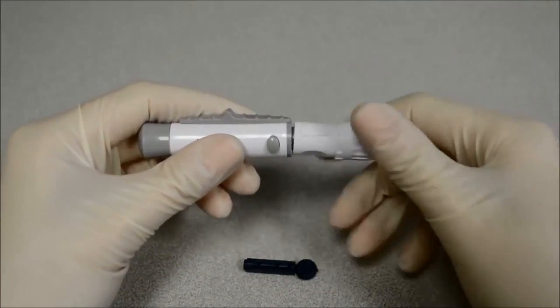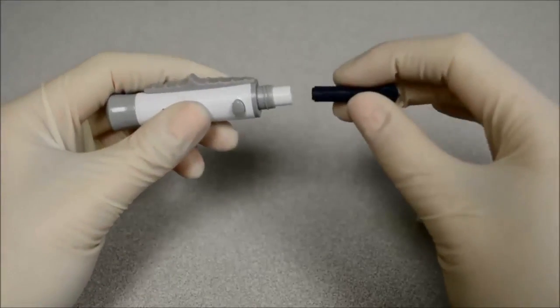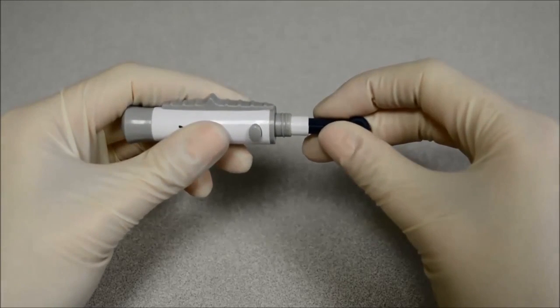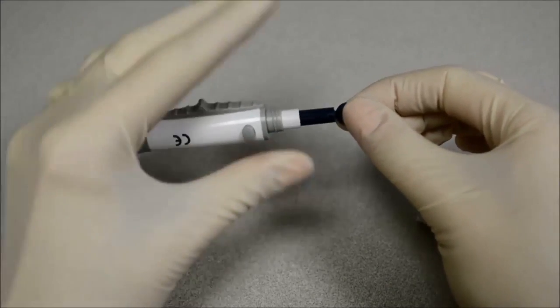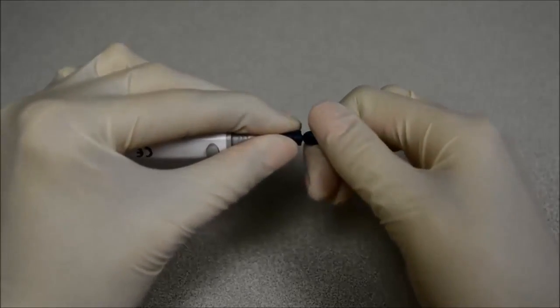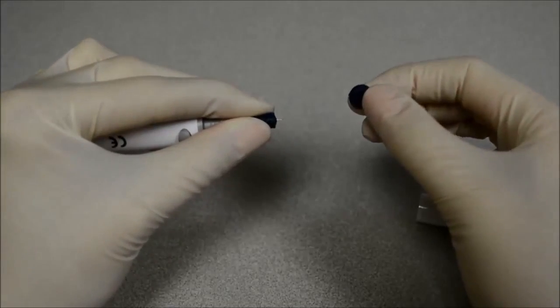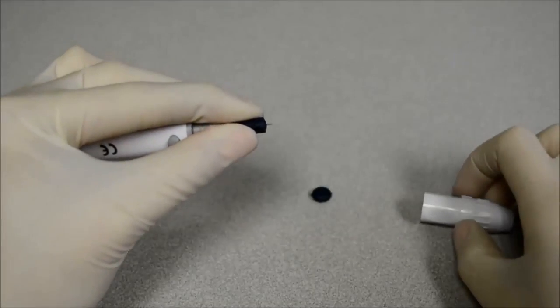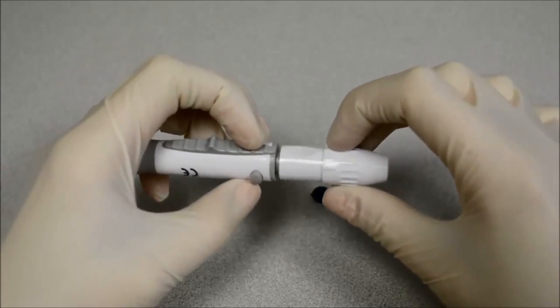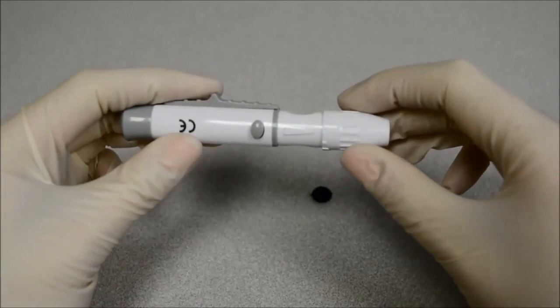Unscrew the lancing device cover from the body of the lancing device. Insert a sterile lancet into the lancet holder and push it until the lancet comes to a complete stop in the lancet holder. Hold the lancet firmly in the lancet holder and twist the safety tab of the lancet until it loosens. Then pull the safety tab off of the lancet. Carefully screw the cover back onto the lancing device. Avoid contact with the exposed needle.